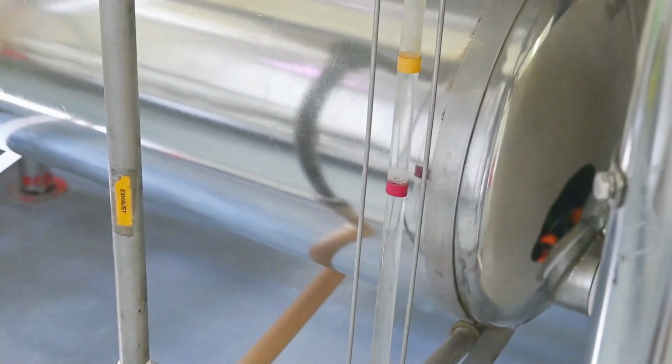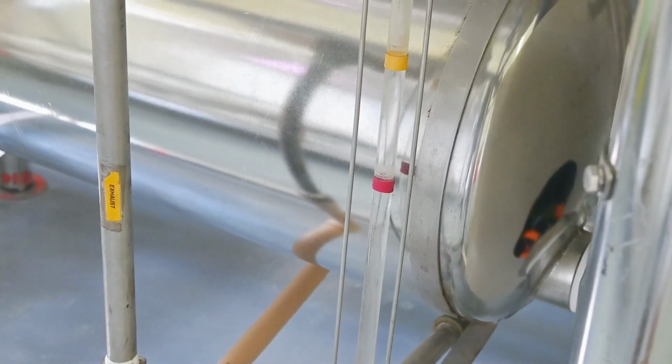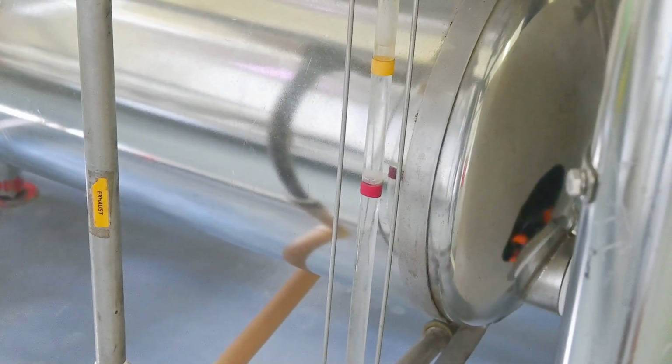So while I'm filling, you'll see the water level going up. And as it settles in the tank, you will see the true level of where the water is when I'm then adding it.